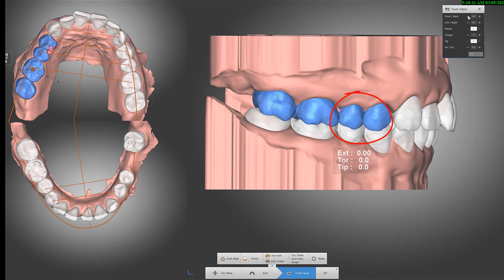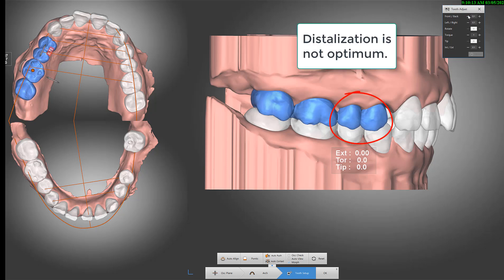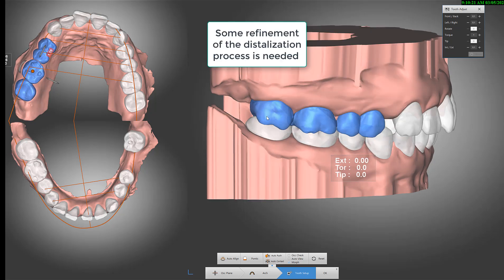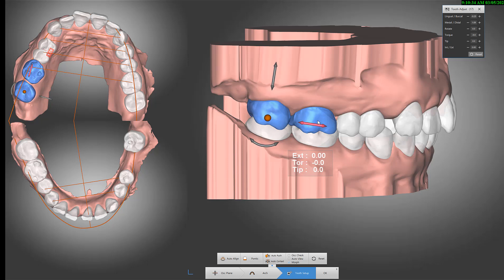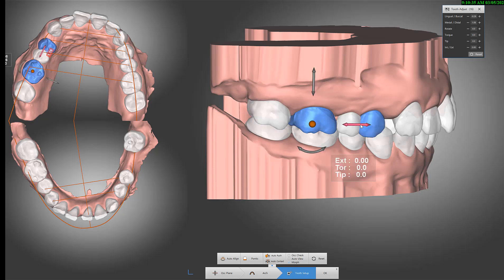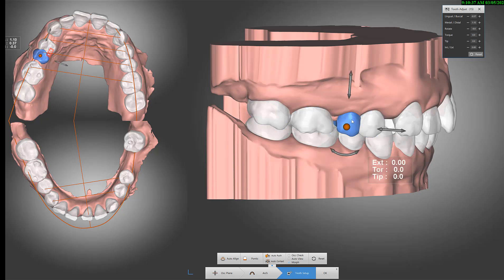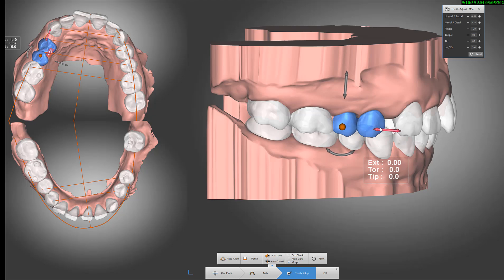This particular software has a small issue here — the distalization is linear, so you have to be careful with that. It's not exactly like it would happen on the patient, so you have to compensate.